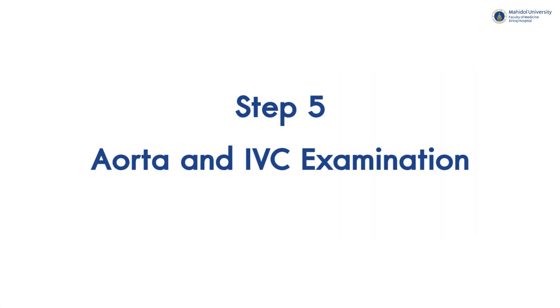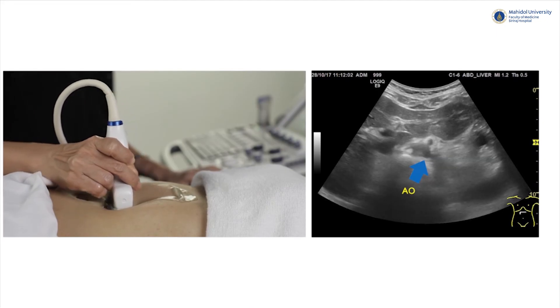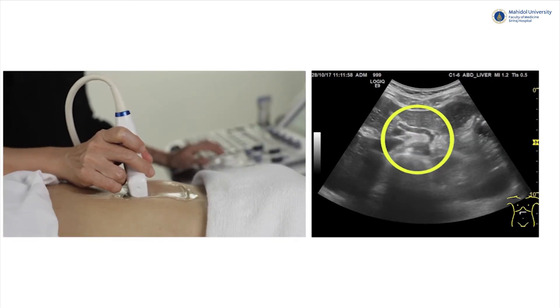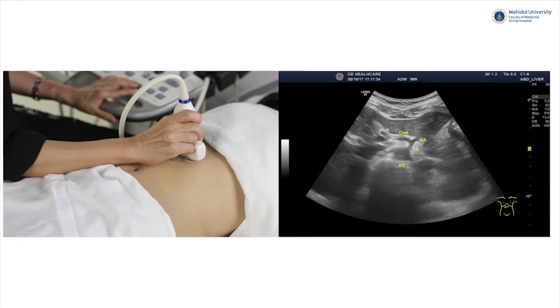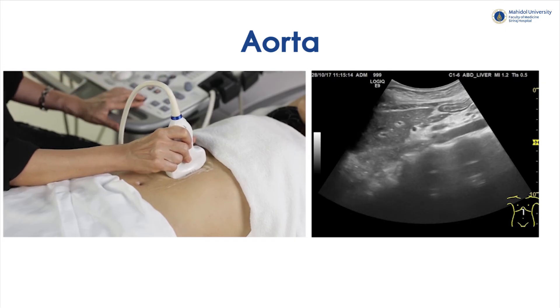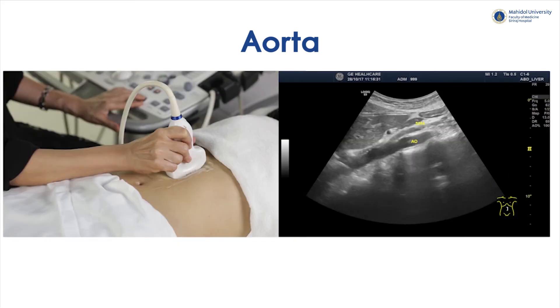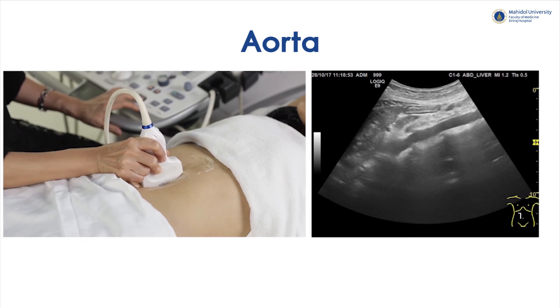Step 5: Aorta and IVC examination. In transverse plane, the aorta locates to the left of the spine, while the IVC locates to the right. Normally, the area around the aorta is clear without any organs surrounding it. We might see aortic branches like the celiac artery and superior mesenteric artery branching off from the anterior part of the aorta. In longitudinal plane, the aorta is at the left side of the body, with a slightly thick wall and appearing pulsatile. We may see its branches like the SMA very clearly, especially in thin patients, and can trace down along the aorta towards its bifurcation.